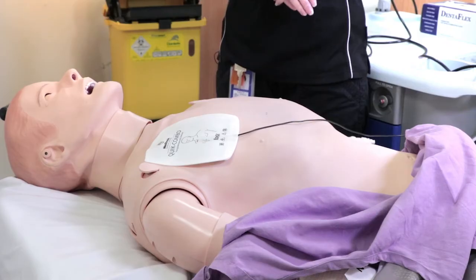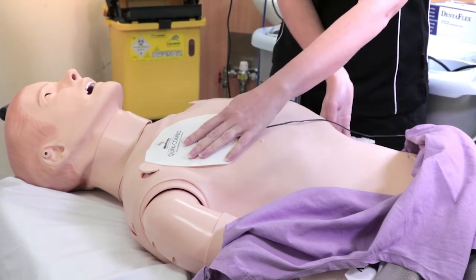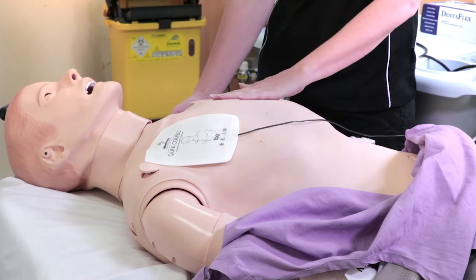Cardioversion can also be performed with your LifePak defibrillator. According to the ARC's tachycardia algorithm, if your patient is unstable and has developed a reduced level of consciousness, systolic blood pressure lower than 90, chest pain, shortness of breath, or is poorly perfused, you need to attempt synchronised cardioversion. Connect quick combo pads in the anterior-lateral position — anterior-posterior can also be considered for large patients.